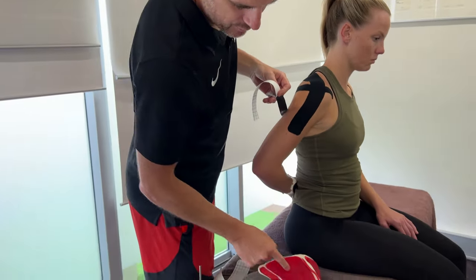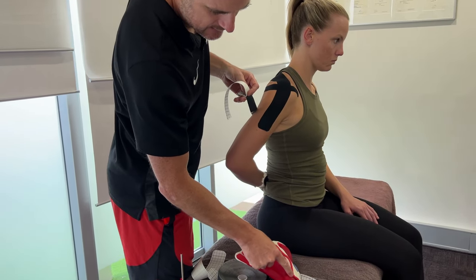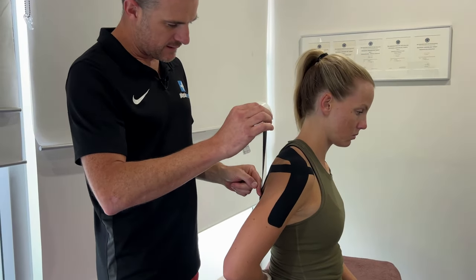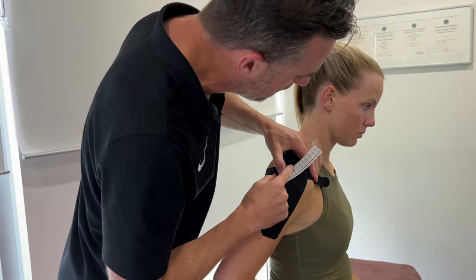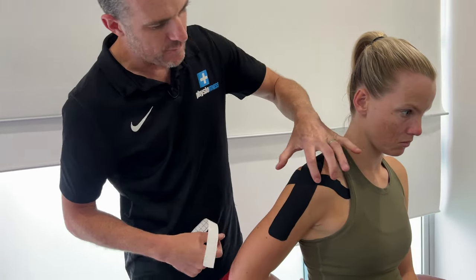For the second infraspinatus strip, same drill — follow this line here. We're also doing one for the teres minor, so come up to just under the acromion where the first strip ended. From that anchor point, apply 75 to 100% tension, same sort of drill — come up and meet it, and you can almost overlay the top part at the insertion point. You can separate the anchors at the bottom but overlay at the top.